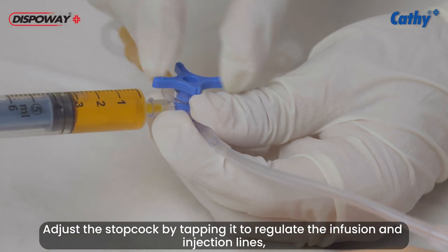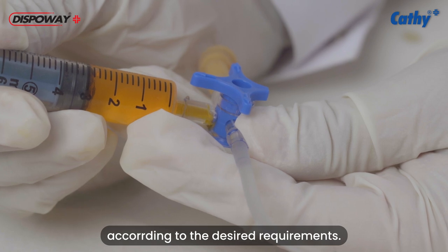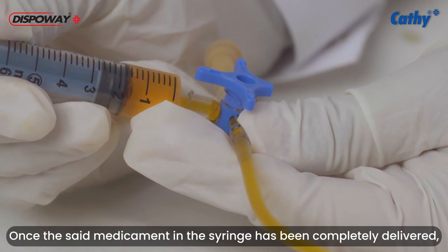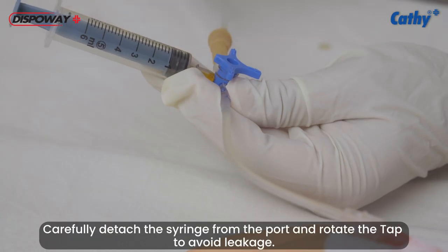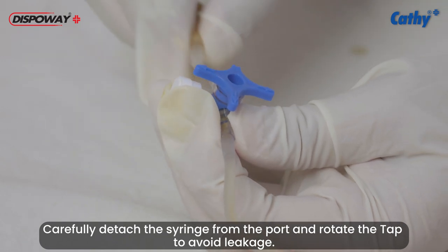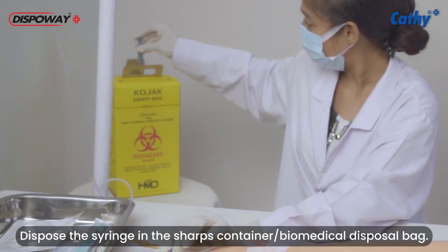Adjust the stopcock by tapping it to regulate the infusion and injection lines according to the desired requirements. Once the medication in the syringe has been completely delivered, close the port. Carefully detach the syringe from the port and rotate the tap to avoid leakage. Dispose the syringe in the sharps container or biomedical disposal bag.